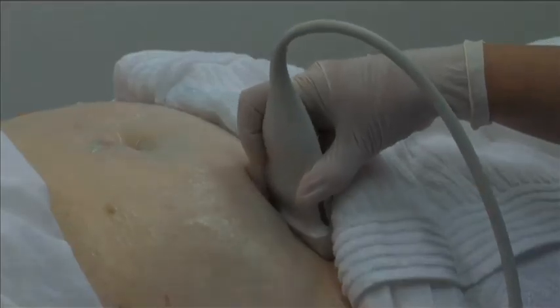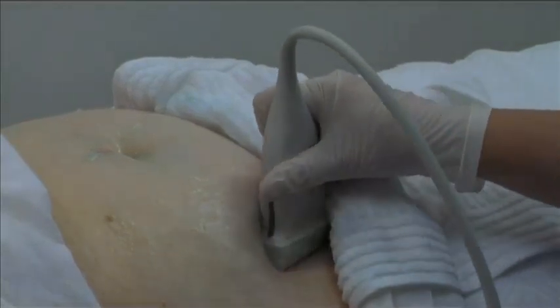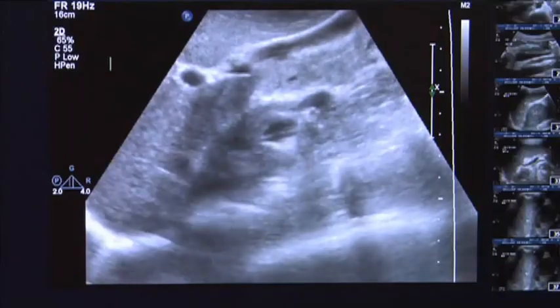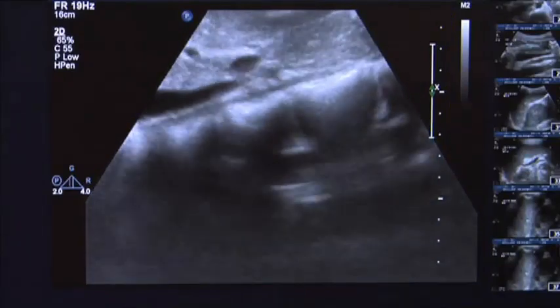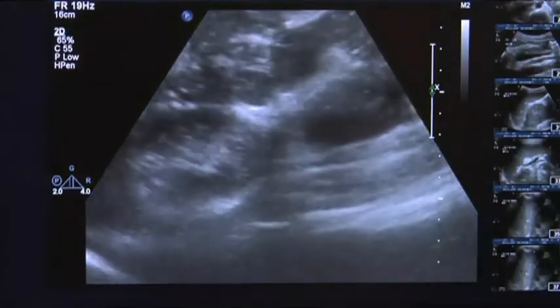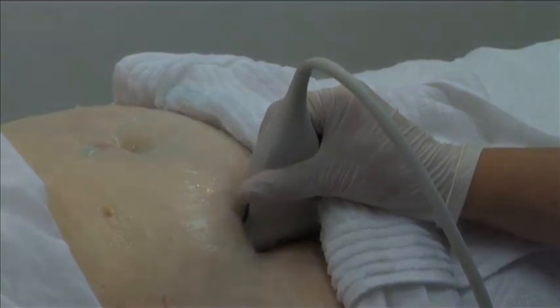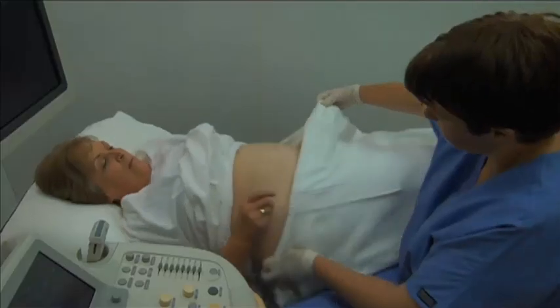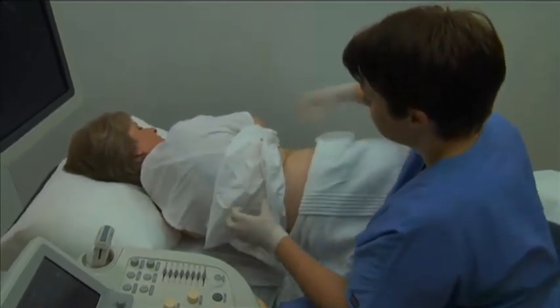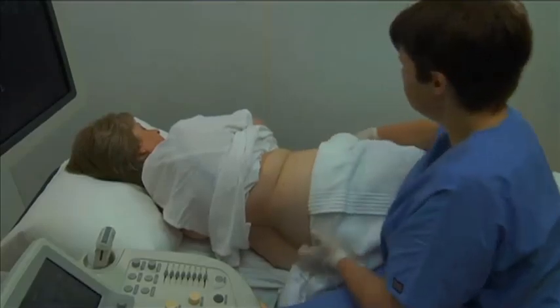Scan the relevant part of the gastrointestinal tract by placing the transducer on the region of interest and rotating to the longitudinal plane. Manipulate the transducer until a suitable longitudinal image of the structure is obtained. This longitudinal view may have to be obtained from an oblique scan plane due to the variable position of the bowel. If required, adjust the patient to the lateral oblique position with the opposite side raised to encourage gas to move away from the region of interest.